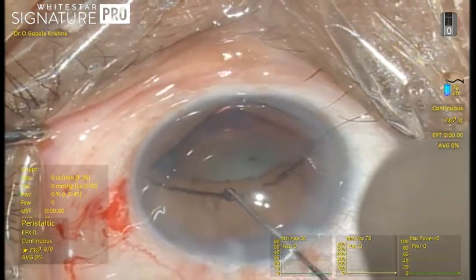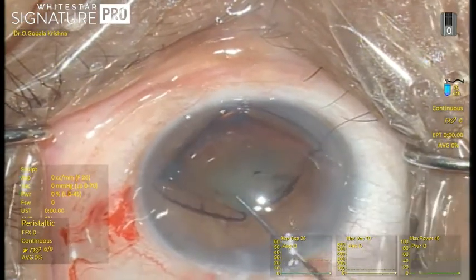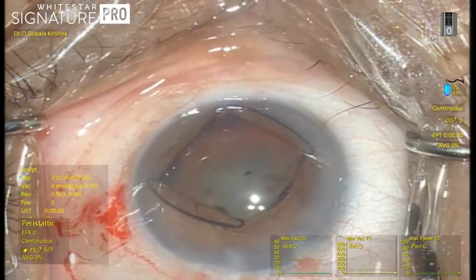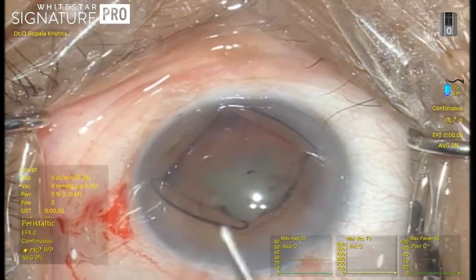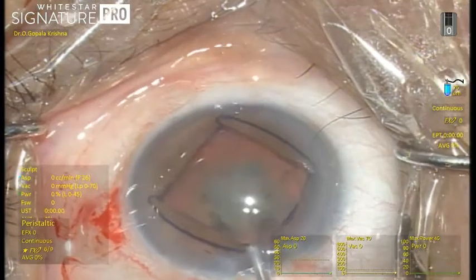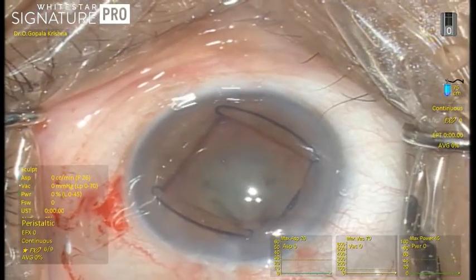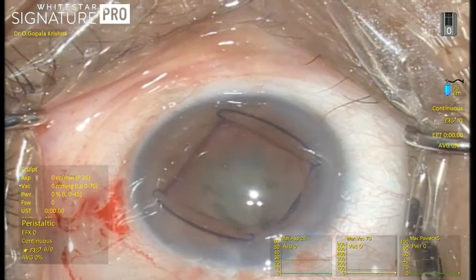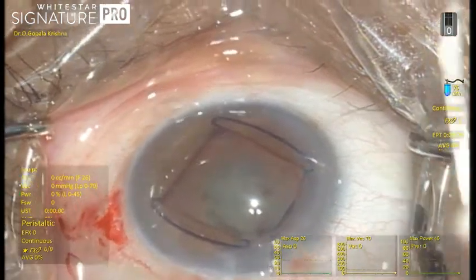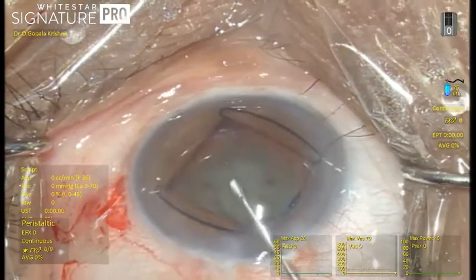First, the trailing scroll towards the incision is loosened from the pupillary margin. Then it can easily be removed with a Sinski hook by gently pulling and drawing it out of the anterior chamber. The scrolls are open, making it easy to pull out.